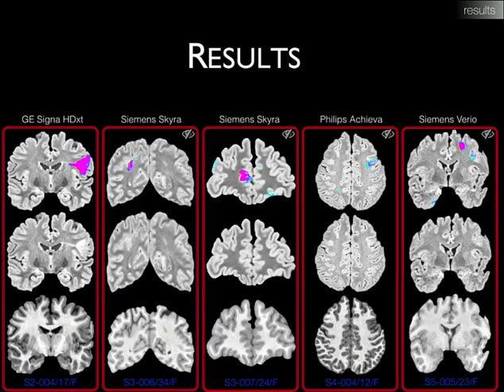So here you can see the prediction overlaid on the FLAIR contrast in the first row. Then you have the concomitant FLAIR and the T1. And these 4 last cases, they were actually MRI negative to begin with. And our algorithm does a pretty good job at detecting these lesions.